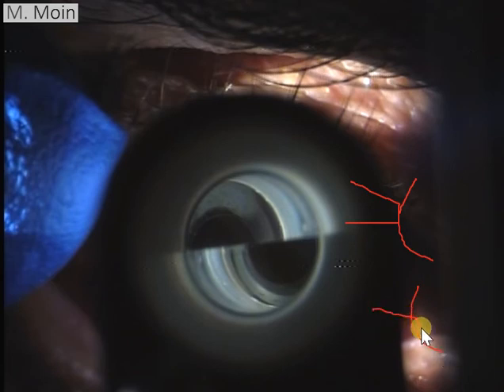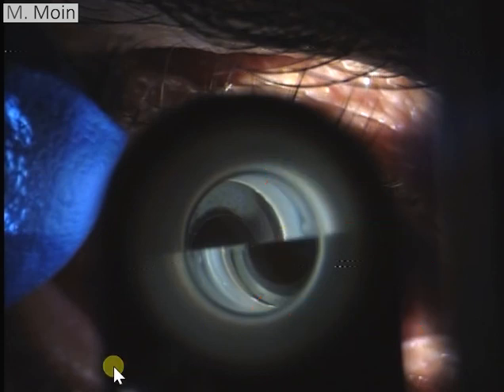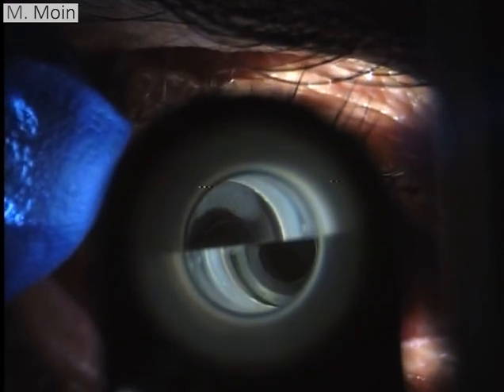Some people like to push that area in, and you will see that if the tonometer is like this, it tends to push backwards when it touches the cornea and applanates the cornea. So actually, when the applanation tonometer is over here, and if it is on that stick, if it touches the cornea, it should not move. It should stay stable in that area or just slightly move backward. So that is another step which you should also know with tonometry. This is a Goldmann applanation tonometer using the Haag-Streit setup, which we're using.